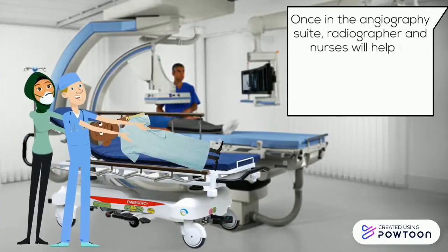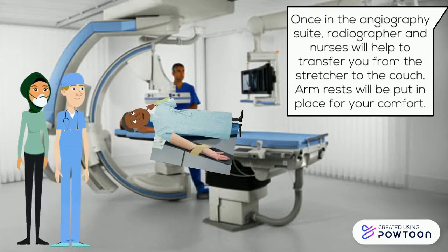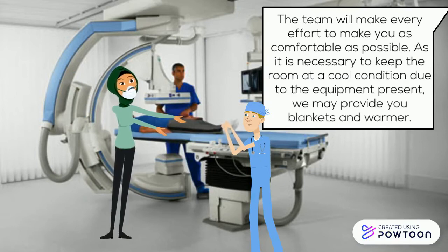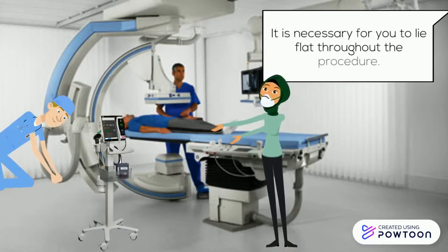Once in the angiography suite, the radiographer and nurses will help to transfer you from the stretcher to the couch. Armrests will be put in place for your comfort. The team will make every effort to make you as comfortable as possible. As it is necessary to keep the room at a cool condition due to the equipment present, we may provide you blankets and a warmer. It is necessary for you to lie flat throughout the procedure.